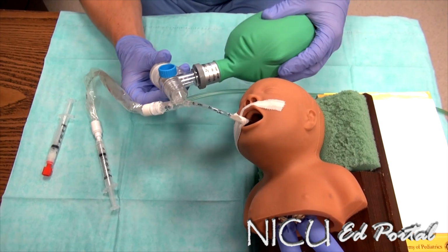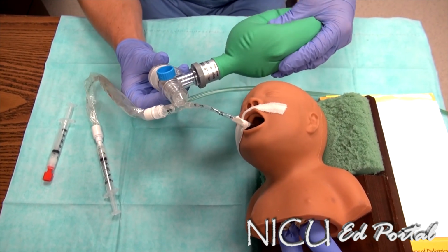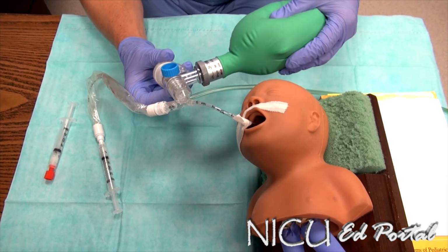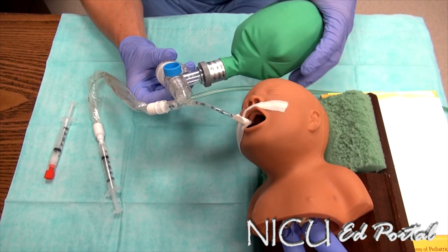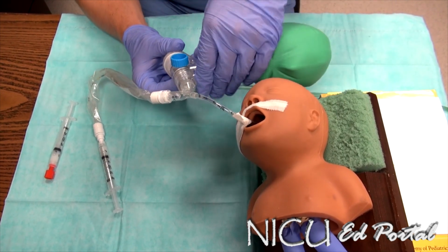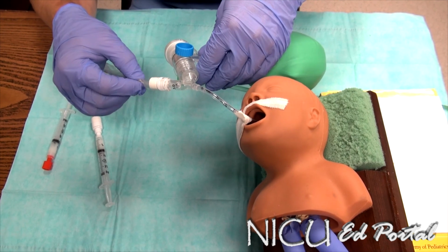So prior, here we're bagging at a normal rate, the baby is stable, we are lifted to the right side, and we're ready to administer our first of the 2 aliquots. So here, I will begin advancing my catheter.